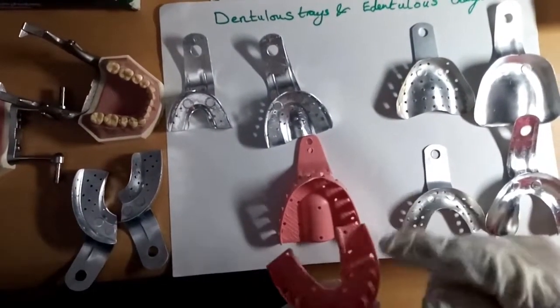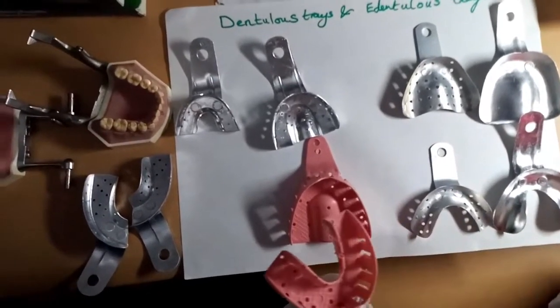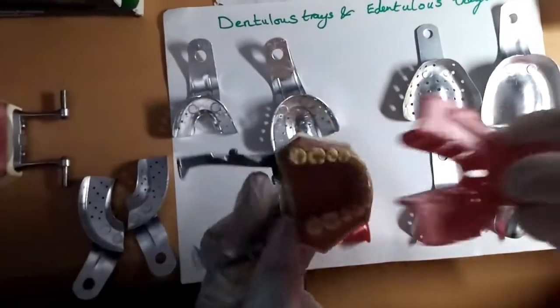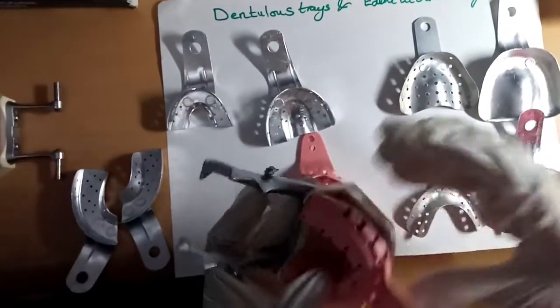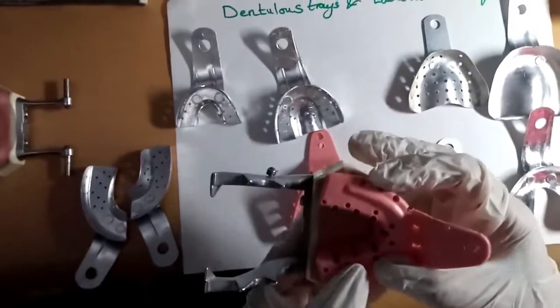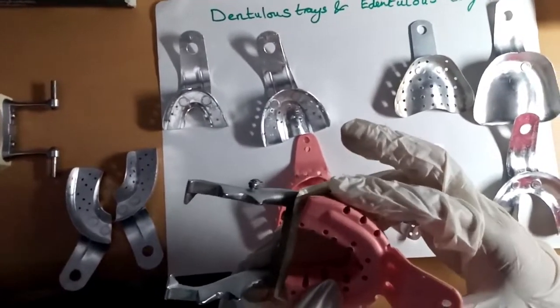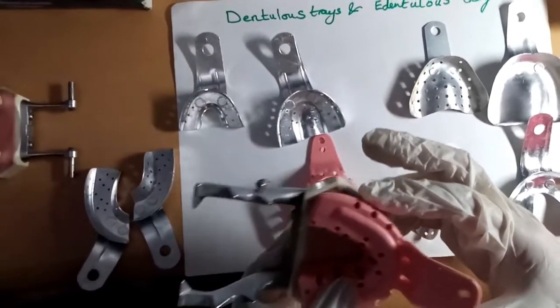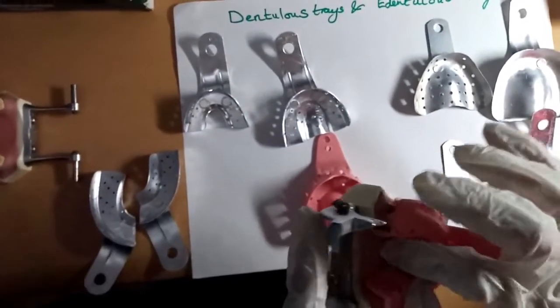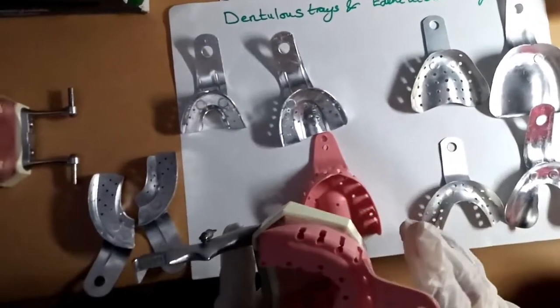Let's shift to the mandibular impression tray. This is the mandibular impression tray. Let's look at how it's done. Okay, this is how it's done. It must cover all the teeth, here, like this. So the mandibular impression tray records the flange area and the lingual area, okay? This is the lingual area, and this is the flange area.